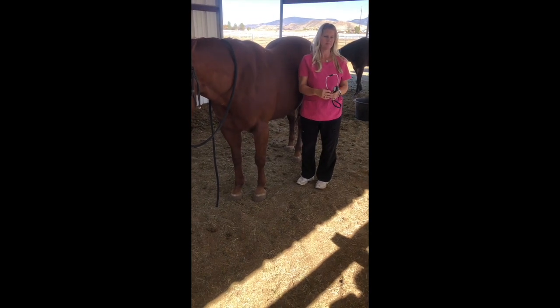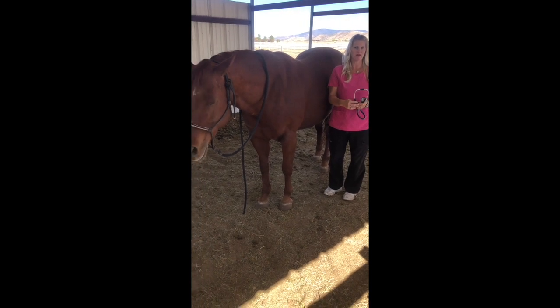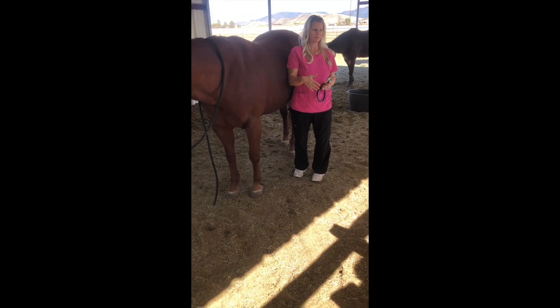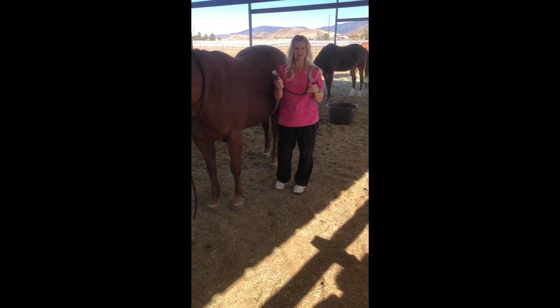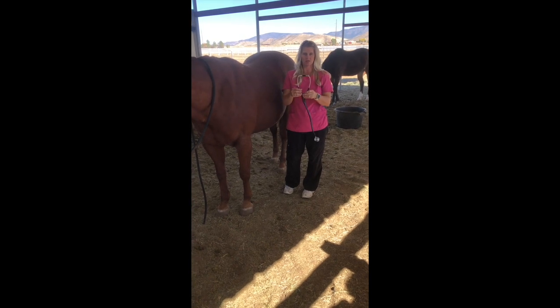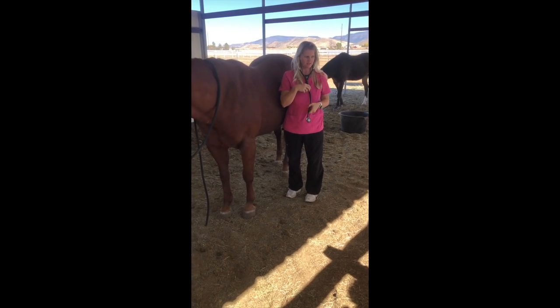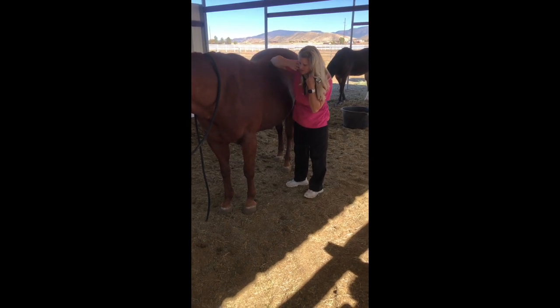Okay, taking the heart rate. The heart rate for the horse, anything normal, is the range between 35 and 45 beats per minute. And abnormal is anything over 80 or under 20. So how you're gonna take the heart rate is use your stethoscope. You can get these online or at any store, Walmart or Target or any place like that, Walgreens, CVS. They're widely available.